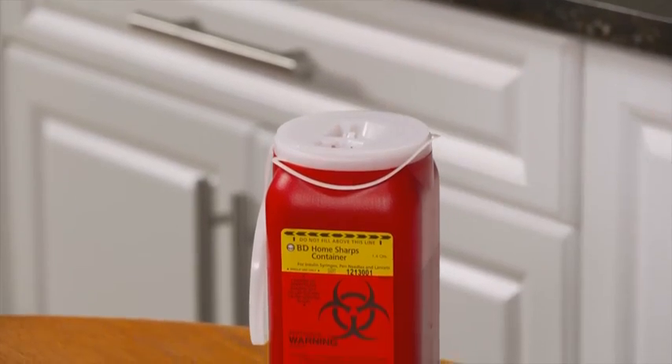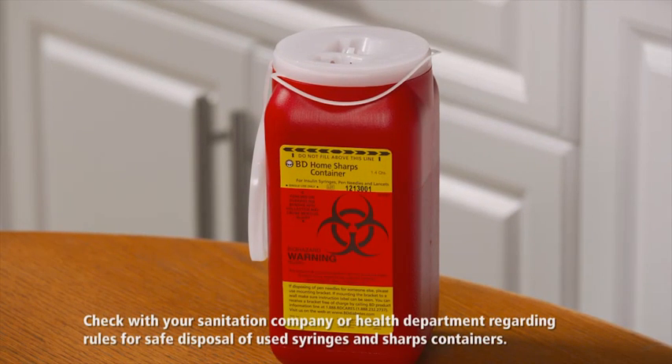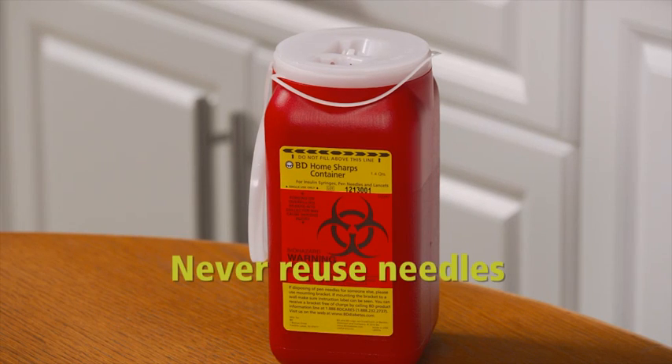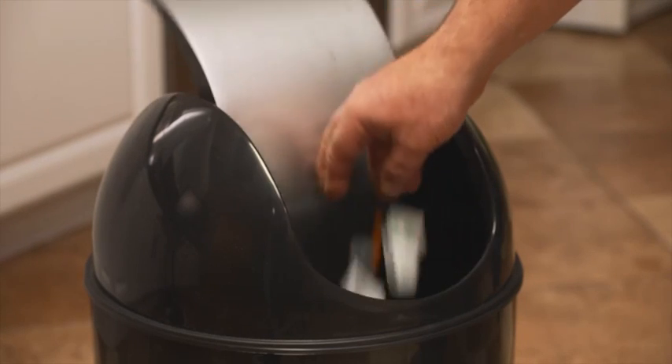And that's it. To finish up, put the used syringe and needle in a sharps container, which you can buy at your local pharmacy. Be sure to check with your sanitation company regarding rules about proper disposal of used syringes and sharps containers. Remember, never reuse a needle after you've injected. The caps and alcohol swabs can be placed with your regular trash. Proper insulin injection technique helps ensure better glucose control, which is critical in managing your diabetes today and over the long term.